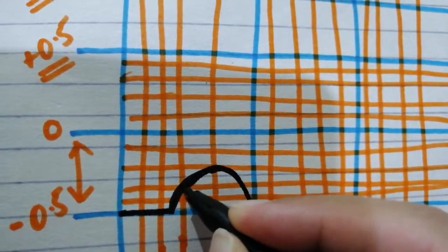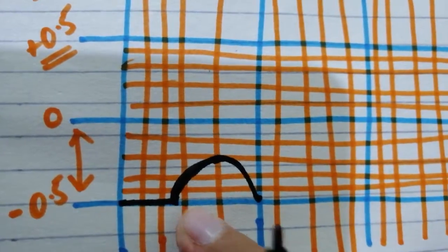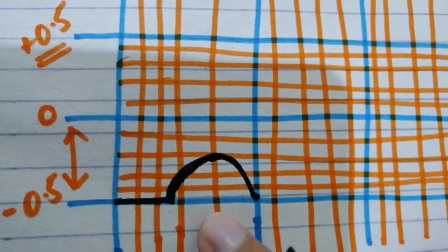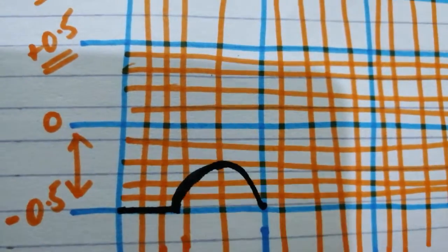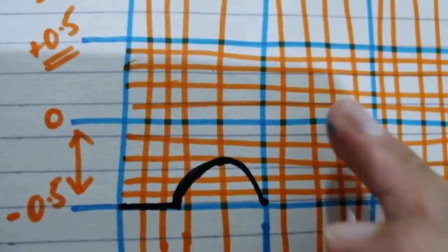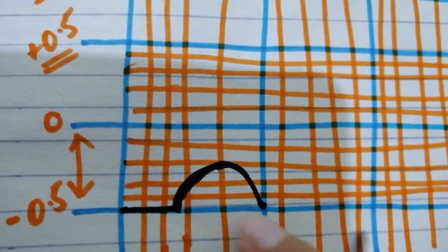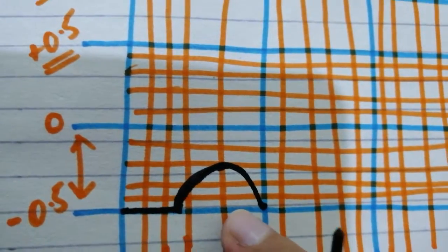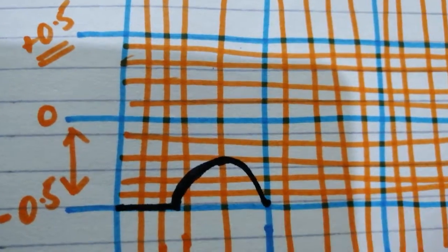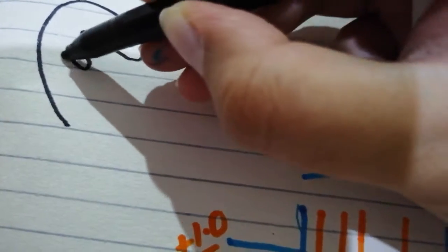This is a P wave, and this is because of a certain electrical event that is happening in the heart. It is atrial depolarization. Not because of the depolarized heart, but because depolarization is still happening, part of the heart has a different potential, the other part has a different one, so there is a potential difference which is recorded in this manner, and this is showing the amount of time it takes for the whole of the heart atria to be depolarized.